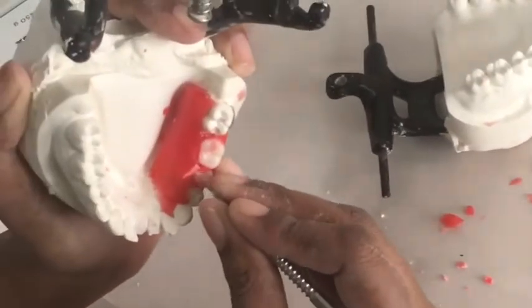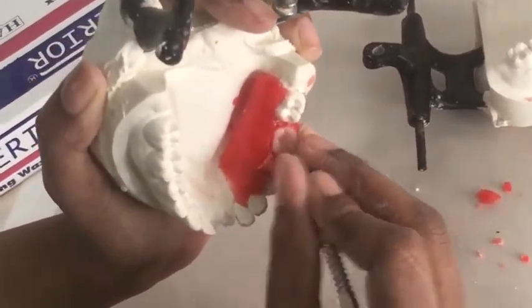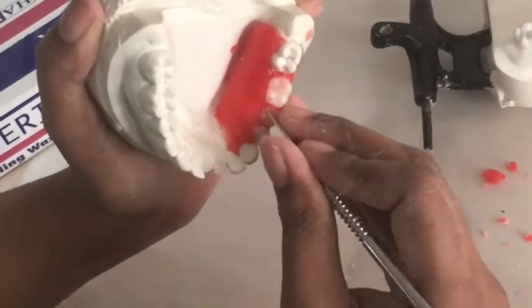Make sure you remove all excess wax from the occlusal area of your teeth, otherwise this will create a hindrance in the proper occlusion.